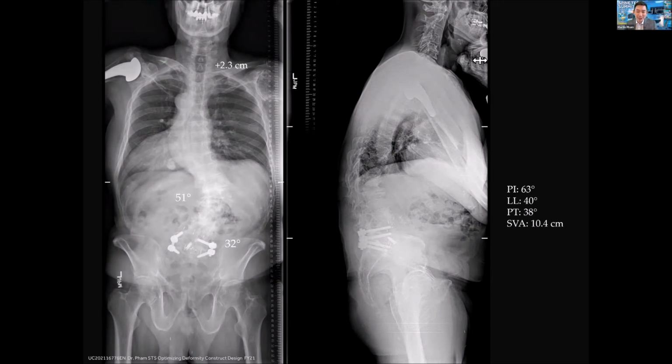But he was exceptionally persistent. You know, he's a developer here. He's used to being exceptionally high functional. He wouldn't take no for an answer. I am easily bullied. And so I told him I would give it a shot and try to plan something that would be safe and robust and still accomplish correcting, you know, the surgical goals.